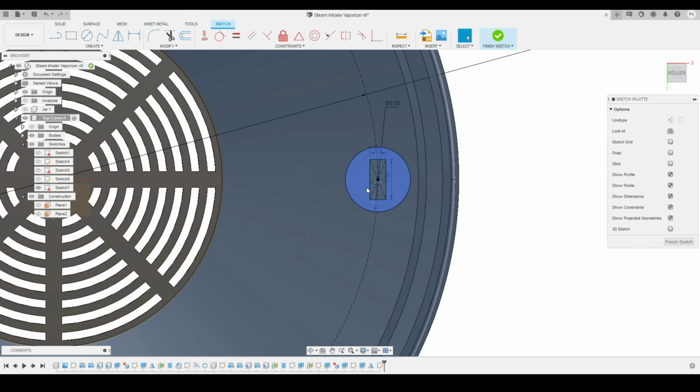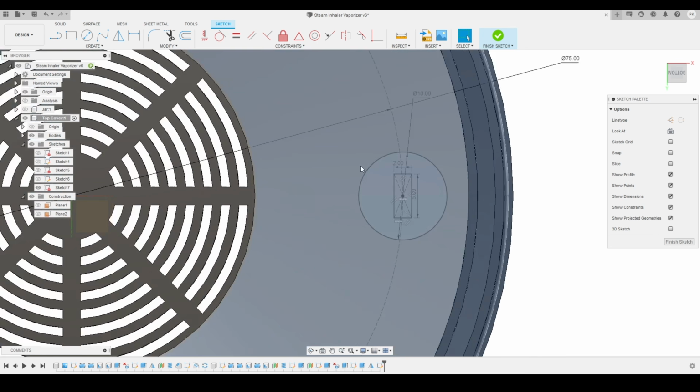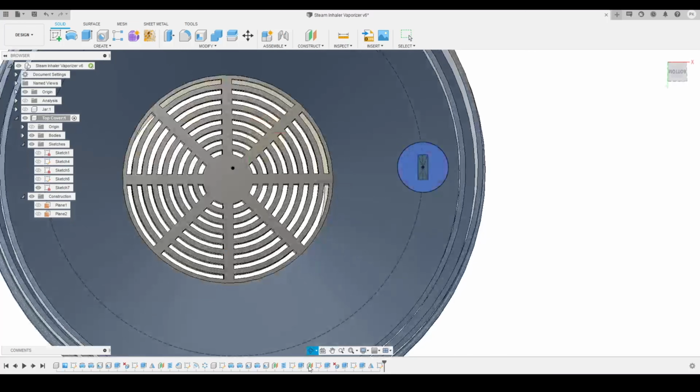So here you can see this is the result we had created, and we'll change this one as 10 as well. And I had to reduce it a little bit, maybe 75 will work. So here you can see now it's looking good. Now we'll click on the finish sketch from here. Here you can see, so this is the profile that we had created.